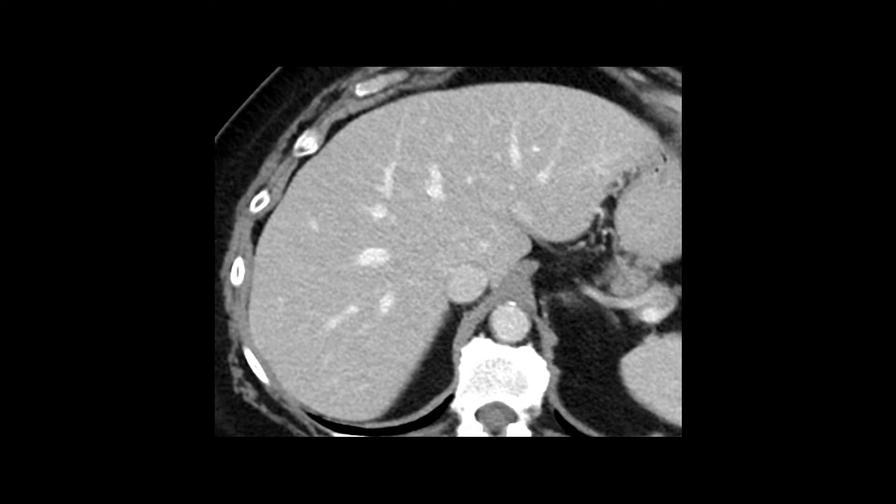The normal liver tissue has a smooth contour and uniform enhancement. The most common variations that you will encounter are fatty liver and cirrhosis.